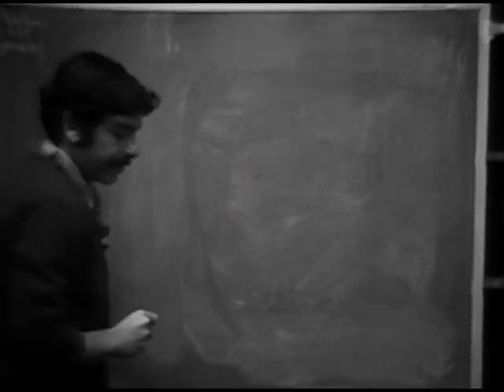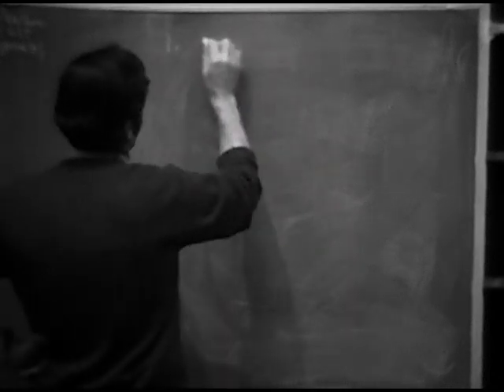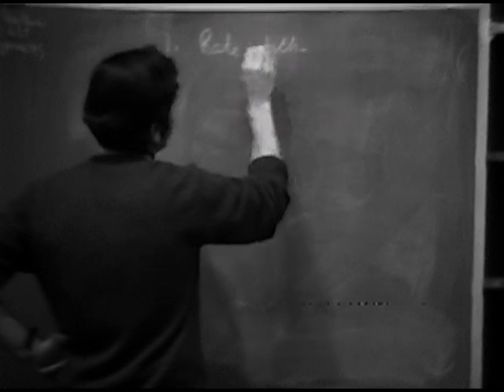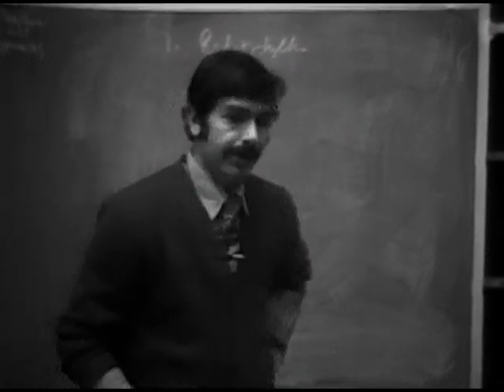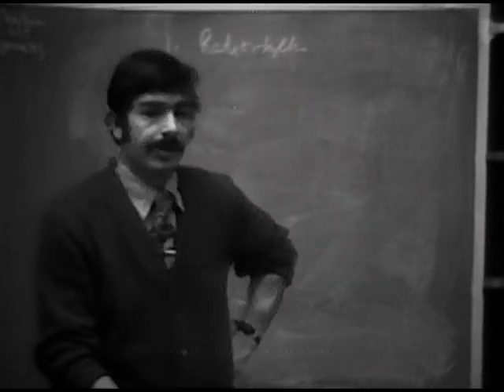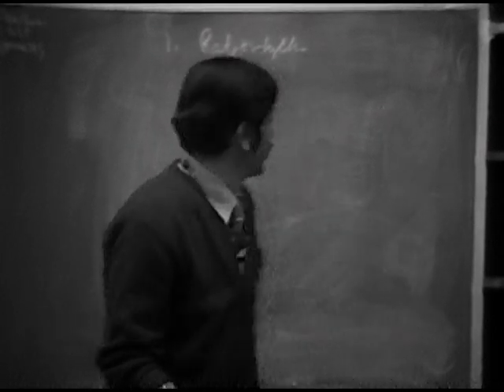So the routine that I found helpful, and suggest, is first thing you do is you look for the rate and the rhythm. Rate and rhythm. We all know how to determine heart rate by now. We'll talk about that. And if you're dealing with an arrhythmia, this is the time to get your calipers out and to decipher that arrhythmia.